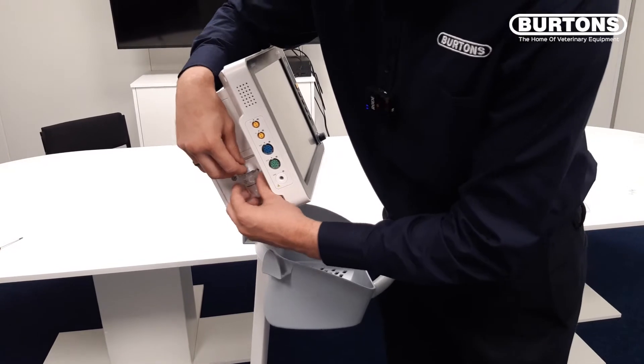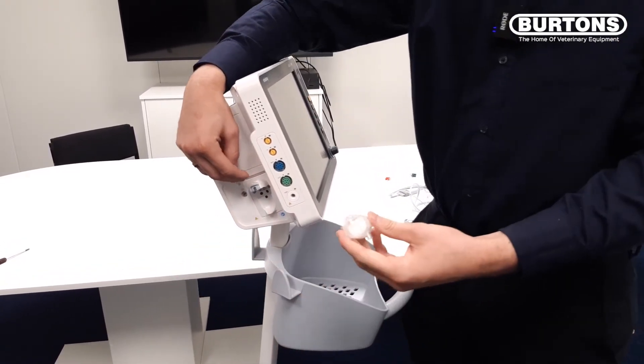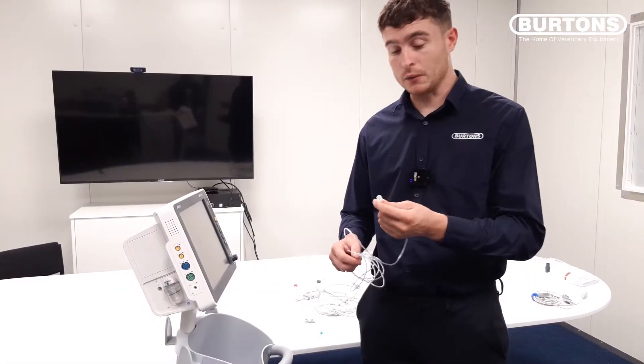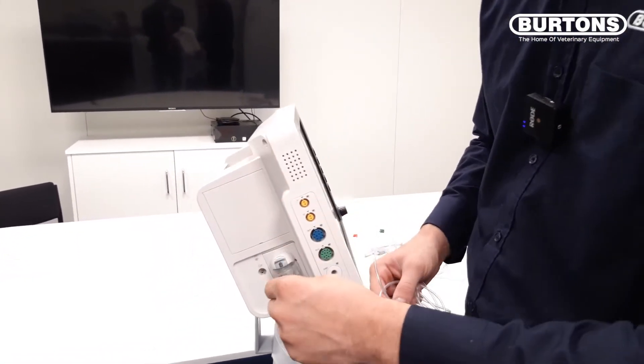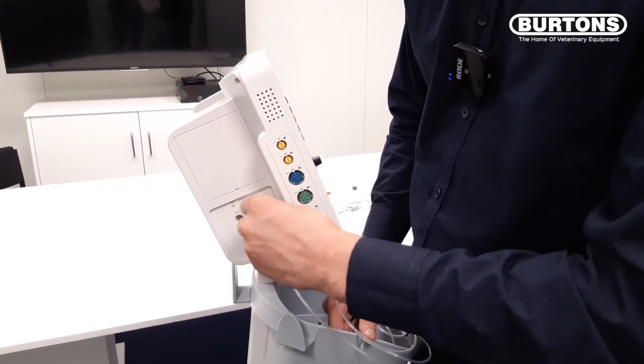To take it out, we just lift the clip again and pull out like that. Next I will show you how to attach the sampling line. To do this you will see a luer lock connector. We just place on like this and twist to secure.